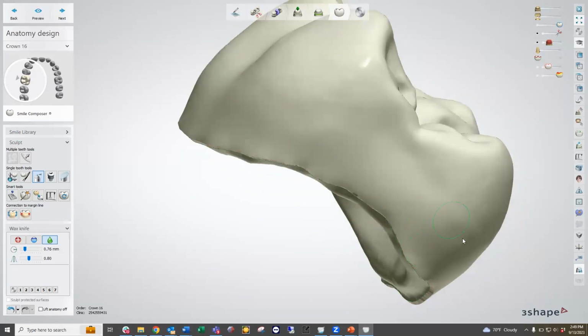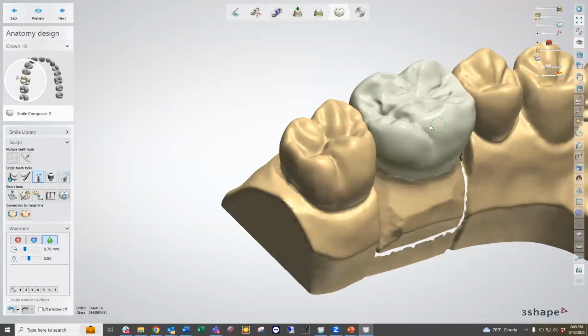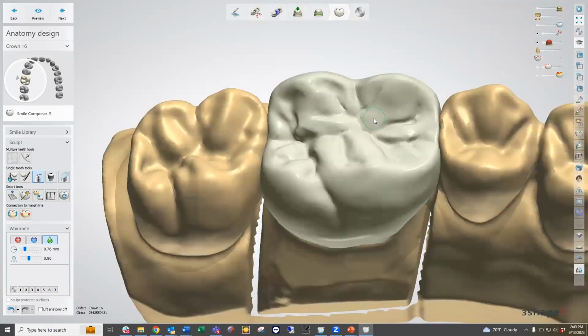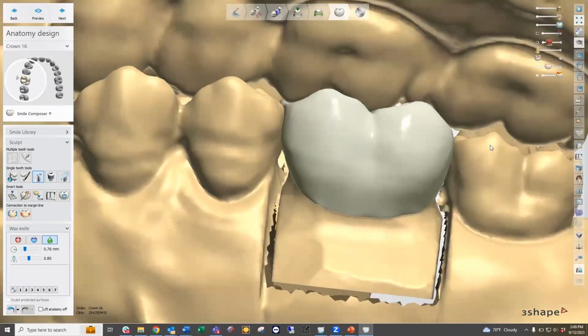And now that we know we have a nice crown that is into occlusion as far as our design goes, and please don't judge me based upon my design. I haven't designed a crown in a while, so it may not look pretty, but we know it's going to be functioning within our occlusion, because we took it out of occlusion the necessary amount that we needed.